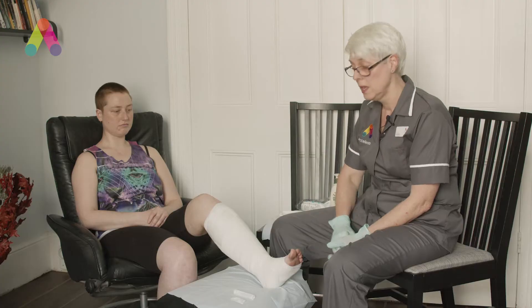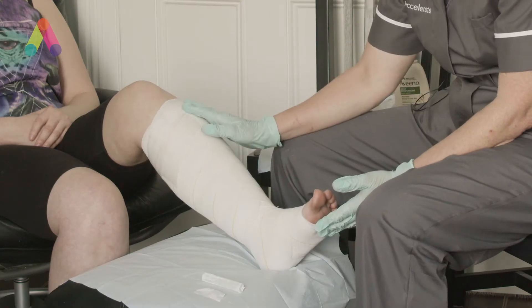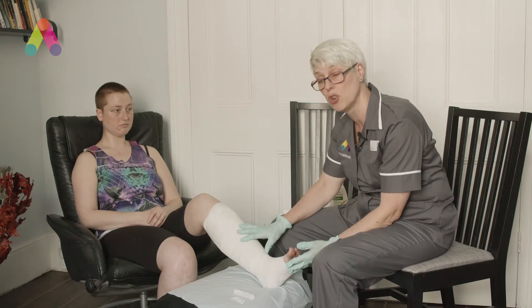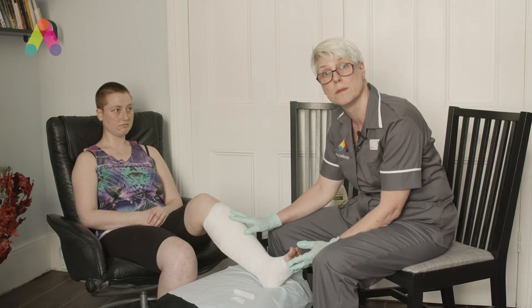Hello, I'm Alison, Chief Exec of Accelerate. This video is part of a series on Optimizing Compression Therapy. In a previous video I showed you that this type of regime — a viscopaste, a paste bandage with a type 3a bandage in a figure of eight — is brilliant for first line treatment. This is very useful for people with neuropathic pain, vasculitis, and so on, where their pain is sharp, sore, and maybe even burning.